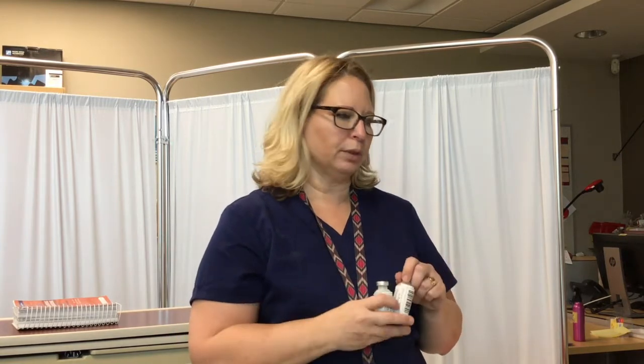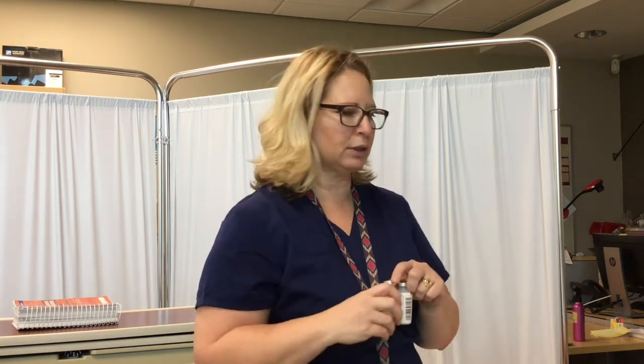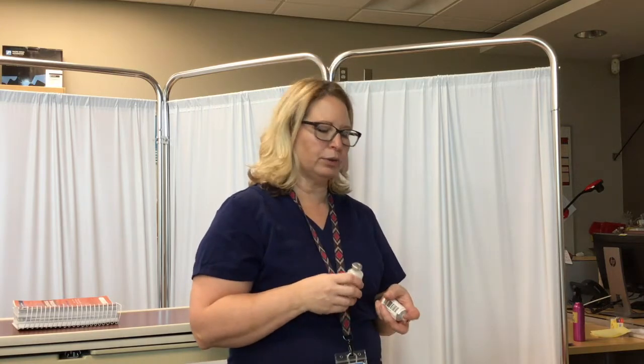So I'm going to show you what it looks like to give both of these meds through a saline lock, and then we're going to go and give both of these meds through an existing line so you can see both scenarios. You don't know what scenario you're going to get in your checkoff. You may have an existing line, you may have a saline lock, so you need to be prepared for both.